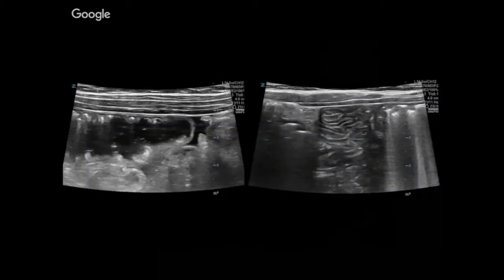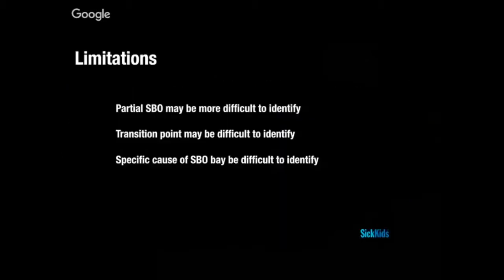The tanga sign is the evidence of extra-luminal free fluid. The plicae are going to tell you it's not large bowel. Large bowel is much larger than small bowel. Limitations of ultrasound for small bowel obstruction include: it's very hard to identify partial SBO because we're looking for signs of complete closure; the transition point can be difficult to identify; and the specific cause can be difficult to identify. It's important to recognize those limitations, especially when involving other specialties and consulting surgery.